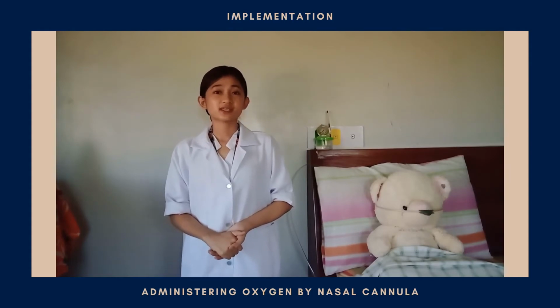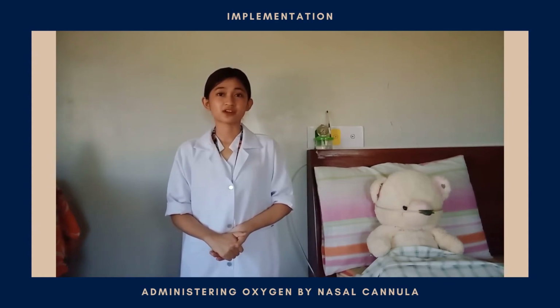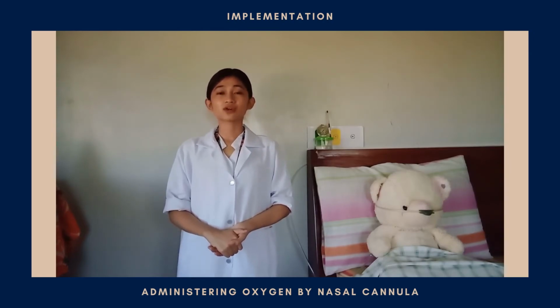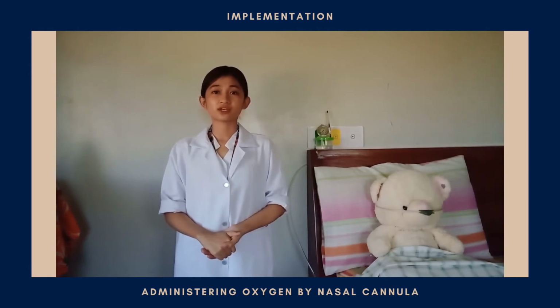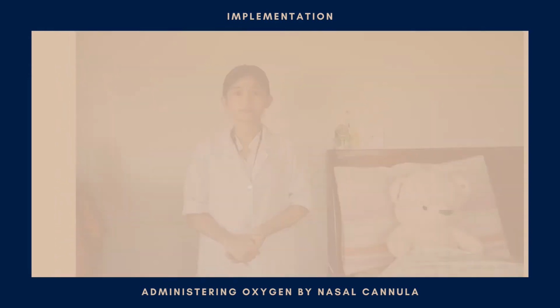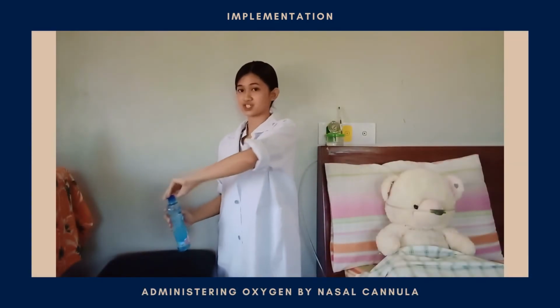Then reassess the patient's respiratory rate, effort, and lung sounds, and note any signs of respiratory distress, such as tachypnea, nasal flaring, use of accessory muscles, or dyspnea. This is to evaluate if we have met or achieved our goal. Remove PPE if used and perform hand hygiene.